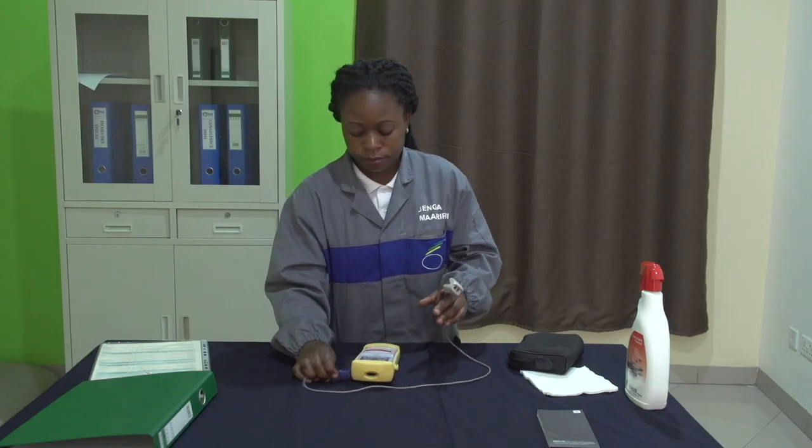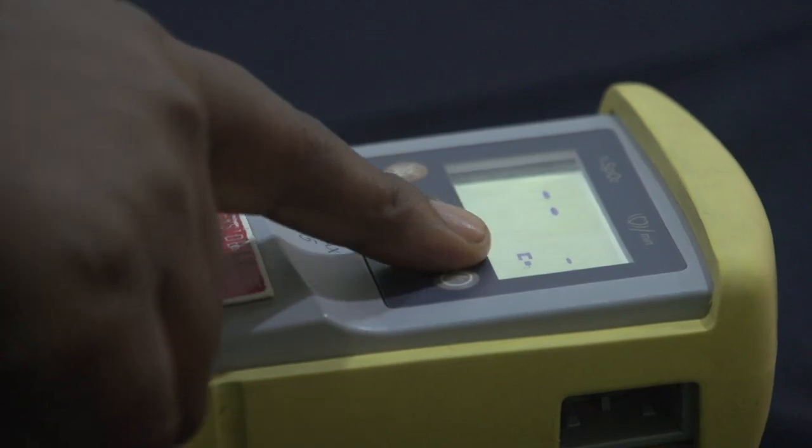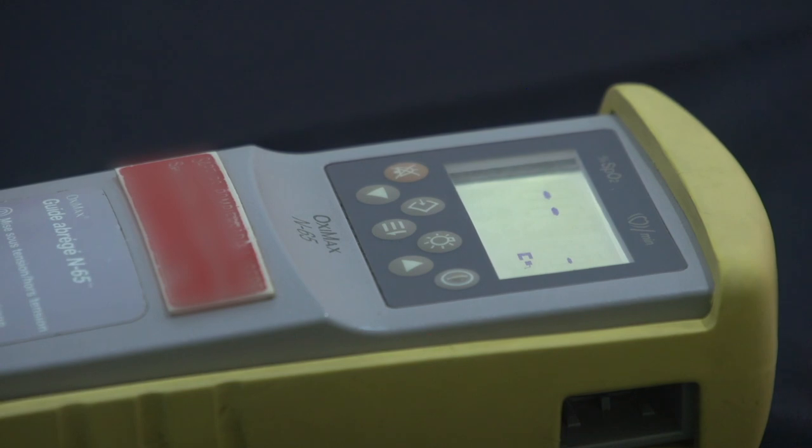L'autre alarme qu'on vérifie, c'est lorsqu'on débranche le capteur. Notre appareil déclenche une alarme pour nous indiquer que le capteur est déconnecté.